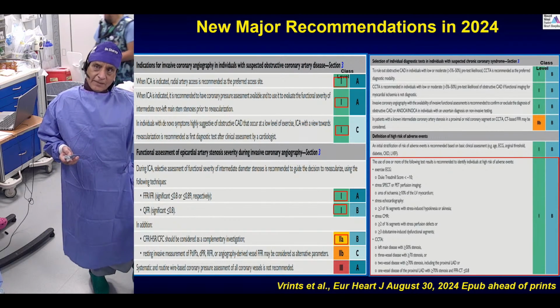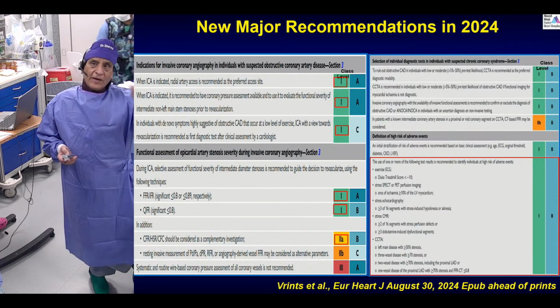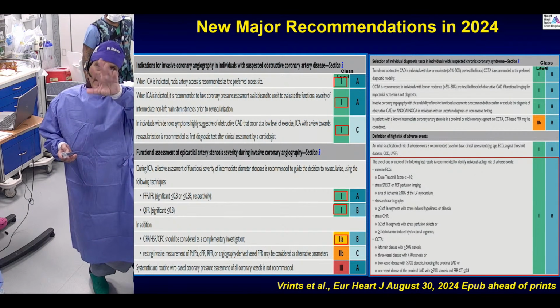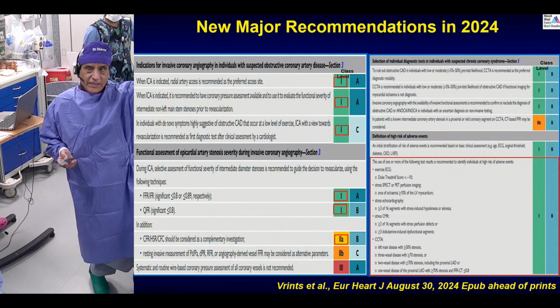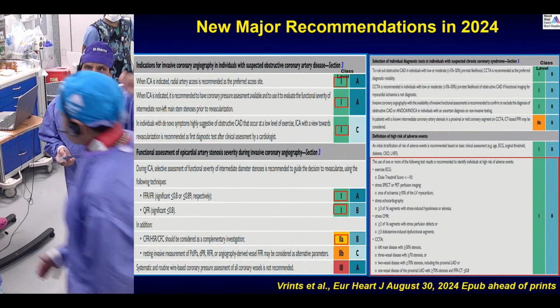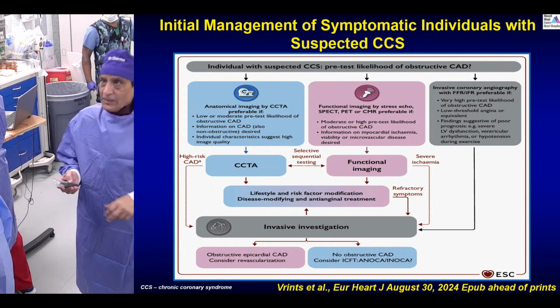But if you are taking the patient after CTA, like our case, you need to do FFR and IFR. That is what became QFR, and FFR, IFR, all class 1 indications. So for the patient, based on the CTA, unless the CT FFR has been done, you need to do those FFR and QFR, which we did in our case. And then of course the patient with a high risk.